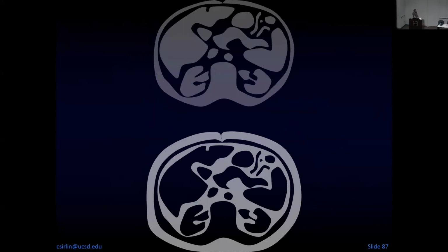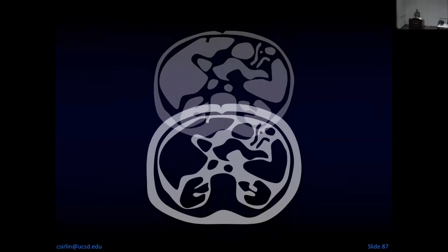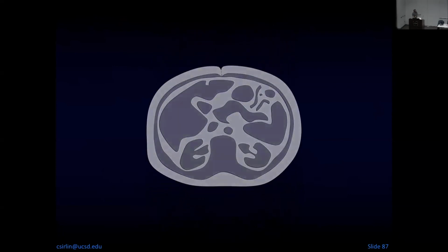And this has two different effects on MR. Let me illustrate the first one here, and then I'll review the second one. Remember I said before that in MRI, we are essentially imaging water and fat, but we are superimposing the two images. So we have a water image and a fat image superimposed.